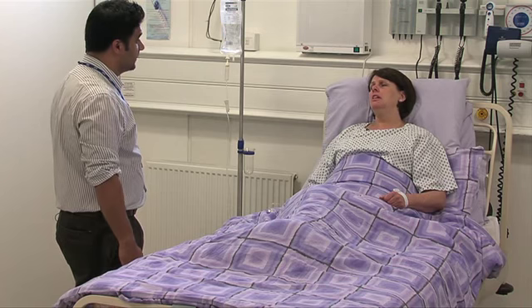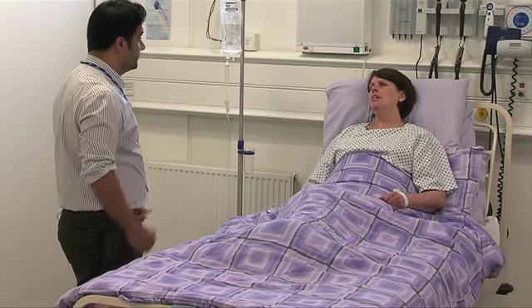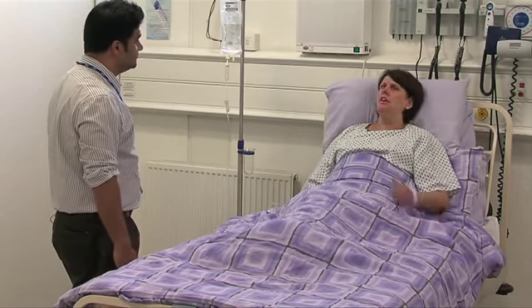That is a plastic tube that we insert via your water pipe into your bladder, and it allows all the urine to drain out, and it decreases the discomfort that you're going through at the moment. Because it's absolutely murder. Is it sore? It's slightly uncomfortable, but we give you some local anaesthetic, which is a lubricant, to ease the discomfort, and it'll be a temporary measure until you're fully mobilised, and then we'll take it out later in the future.